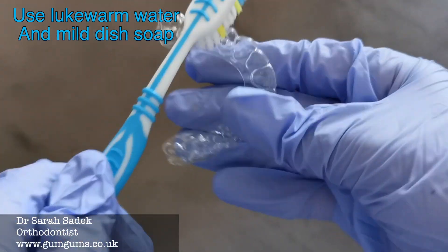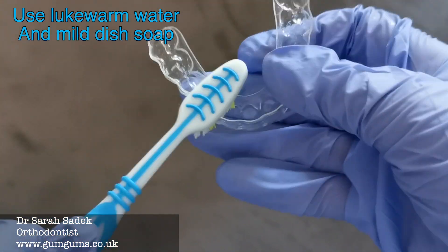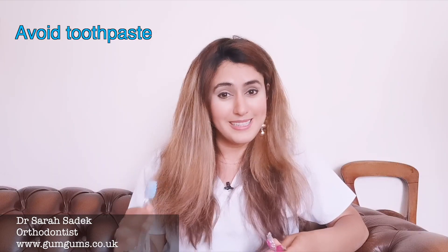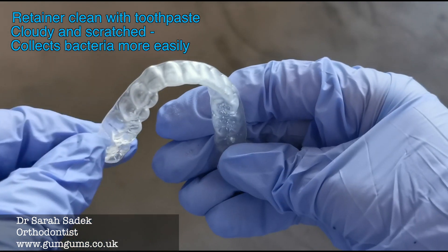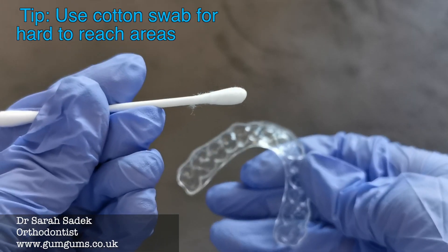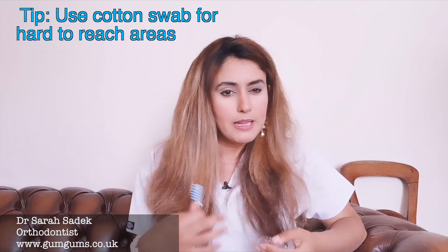For a deeper clean, you can mix lukewarm water with some mild dish soap and get it really clean. Avoid using any toothpaste, because toothpaste is abrasive and it can actually scratch your retainer. Here we can see a retainer that's been cleaned with toothpaste — it has a cloudy appearance where it's been scratched, and bacteria collect a lot more easily on these scratches. So you should use a soft toothbrush to scrub away the plaque and debris. A little top tip: if you've got a cotton swab, you can use this to clean right in between the little grooves of your retainer.